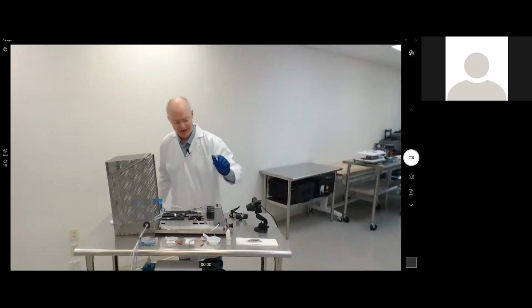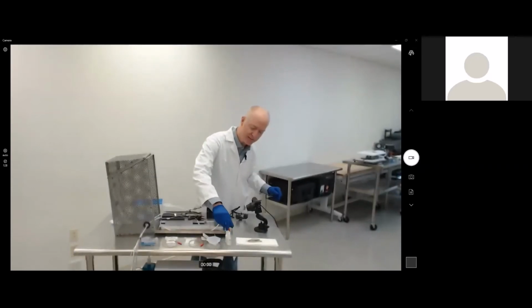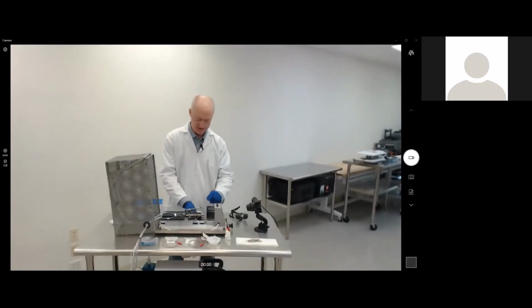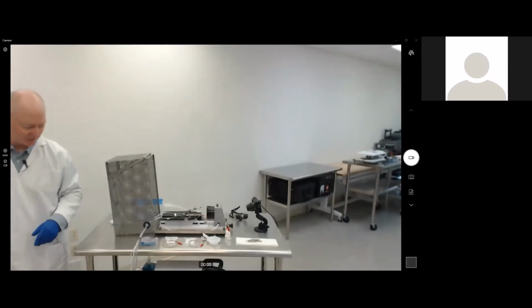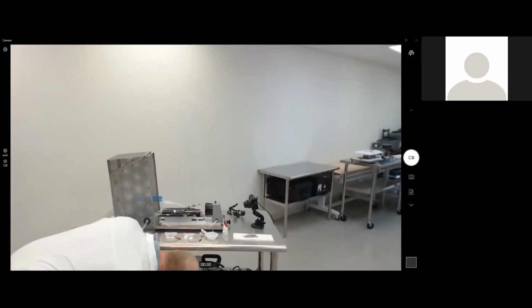And then lastly, I have all my anesthetics, the proparacaine, tropicamide, as well as my coupling media all ready to be used. So that's basically the whole setup. Everything's already pre-connected, so we're ready to conduct the exam. First thing I'm going to do is move our mouse from the induction box and put it into the mask.